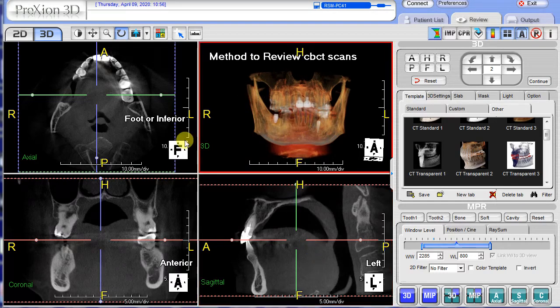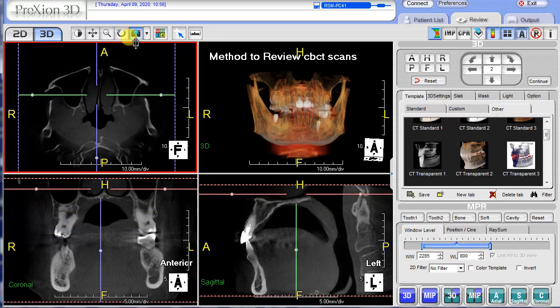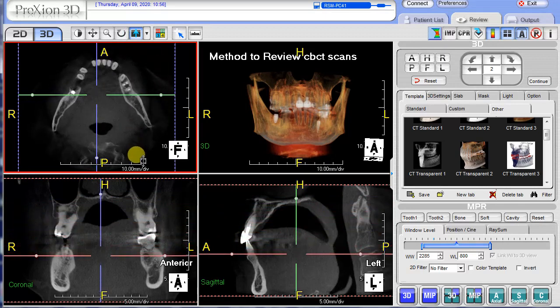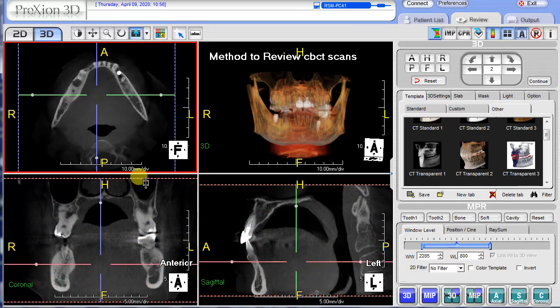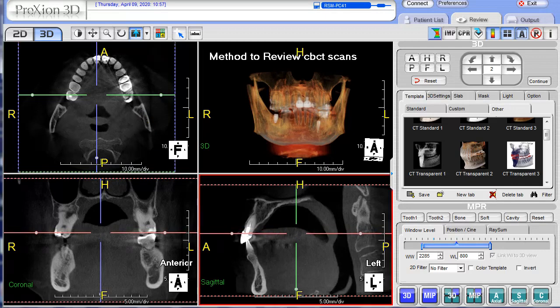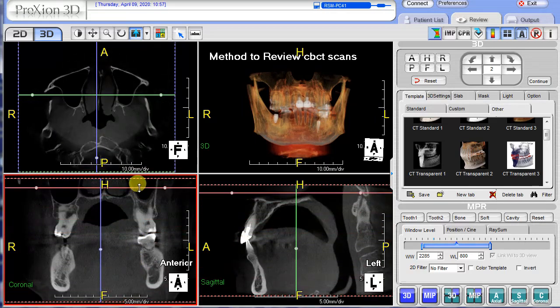For quick scrolling through the arches, put your mouse arrow in the axial screen. Hold your index finger down on the left click on the mouse. With it held down, move the mouse up all the way — you can't go any further. There are the sinuses and nasal, and then you can come down: maxilla, occlusal plane, and down all the way through the mandible. Any time you want to slow down, just scroll the middle wheel on the mouse and you can go a lot slower. You can also grab the pink line and do the same process — scroll all the way down, go all the way back up, evaluating as you go.